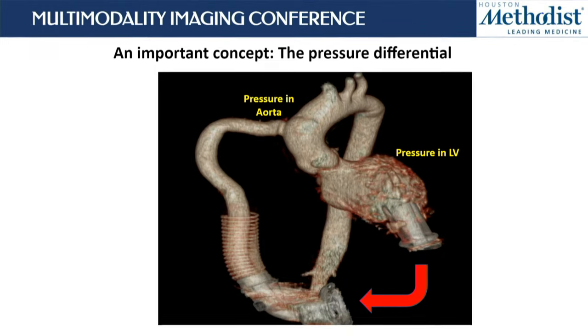The pressure differential concept is very important. That's important for fellows and imagers and people taking care of LVAD. So basically, you have two pressure differentials. One pressure differential is what is between the inflow cannula and the outflow graft. And the other pressure differential is what is between the LV and aorta. These two basically have the propensity to sort of compete with each other in a sense.